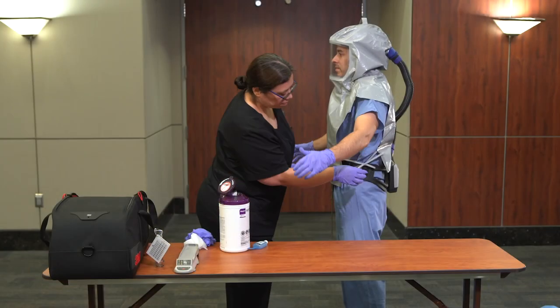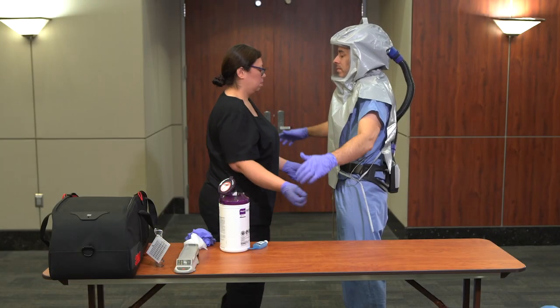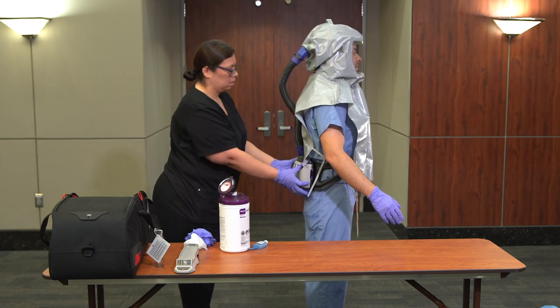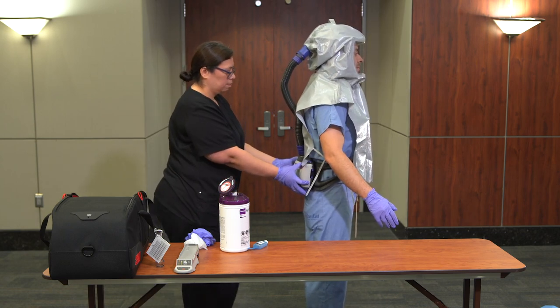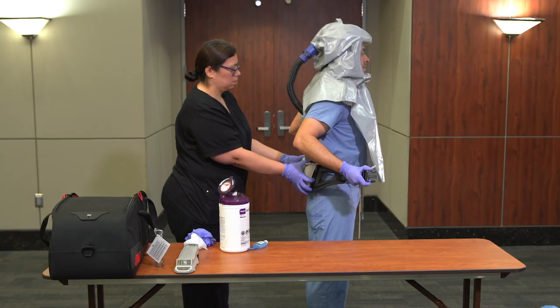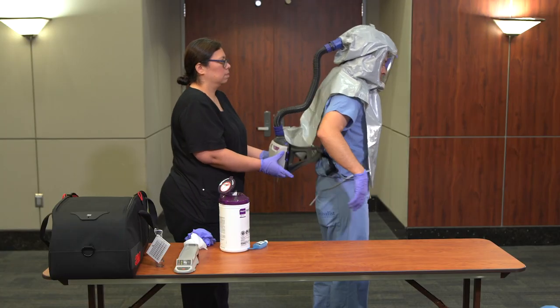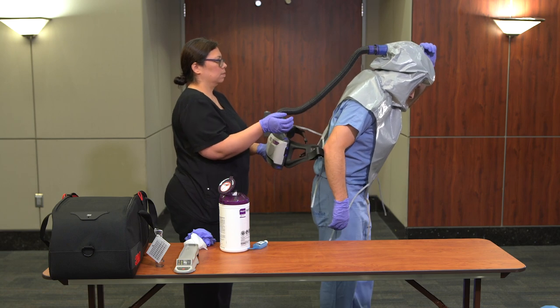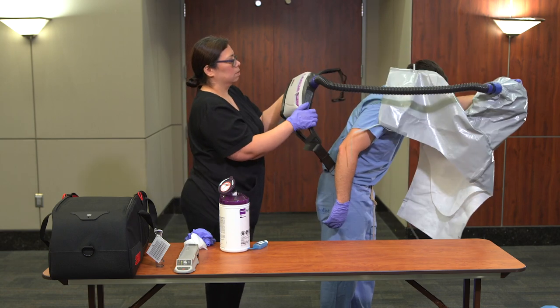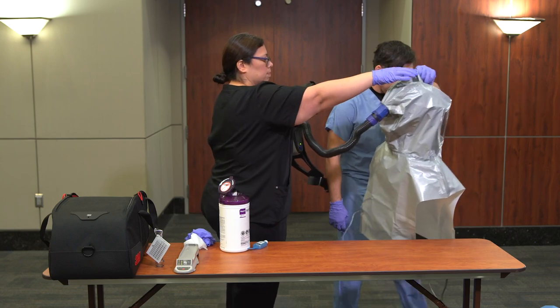The buddy should assist with untying the ties of the shroud. Once completed, turn your back to the buddy and ask him or her to hold the blower assembly. Once the buddy has a hold of the blower assembly, unbuckle the belts and lean slightly forward, then remove the head cover by pulling the loop at the top of the device and lifting up and away from the head.